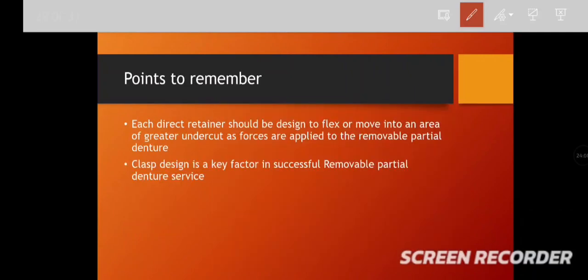Points to remember. Each direct retainer should be designed to flex or move into an area of greater undercut as forces are applied to the removable partial denture. Clasp design is a key factor in successful removable denture service.